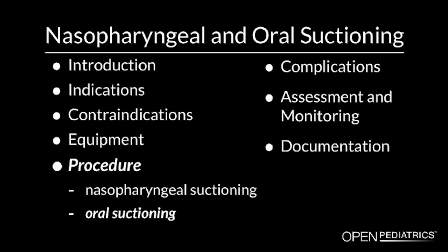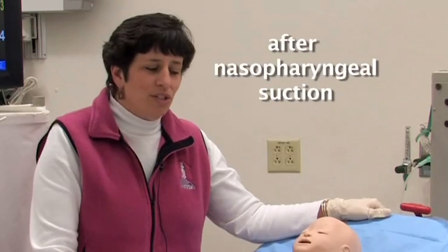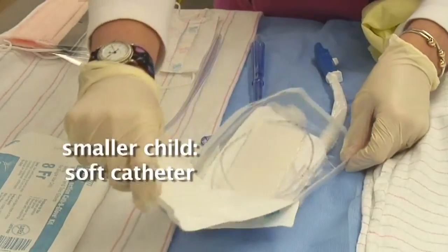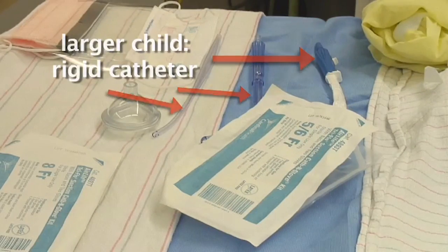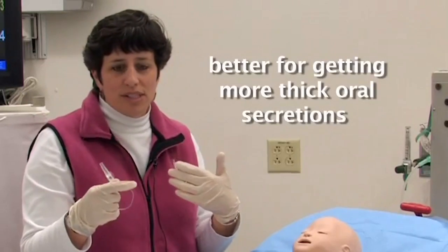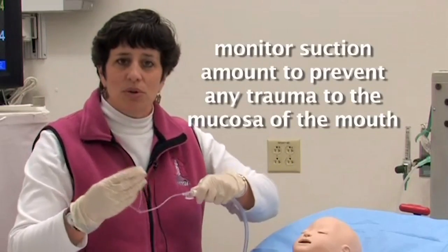I am now going to review the procedure for oral suction. You may do oral suction after nasopharyngeal suctioning, or you may just do oral suction alone. I have already done hand hygiene, put on gloves, and prepared the patient. In the smaller child you may stay with a soft catheter, or in a larger patient you may use a more rigid catheter that is better for removing thick oral secretions. Make sure the suction is not too high to avoid trauma to the mucosa of the mouth.